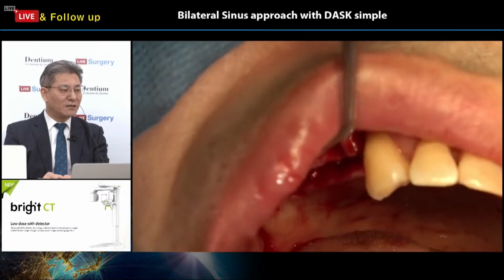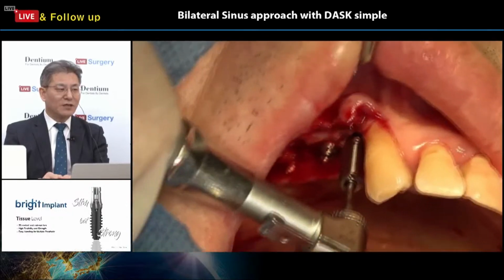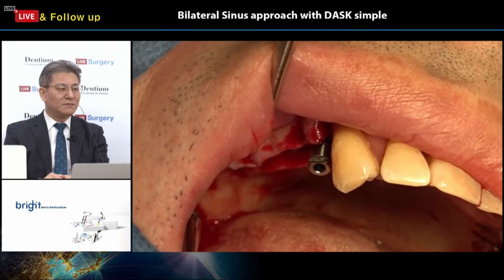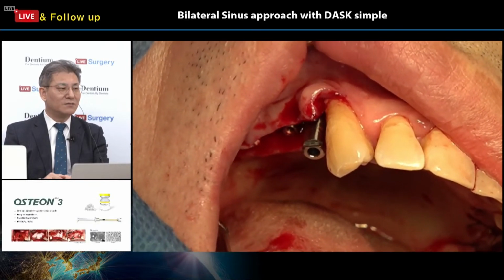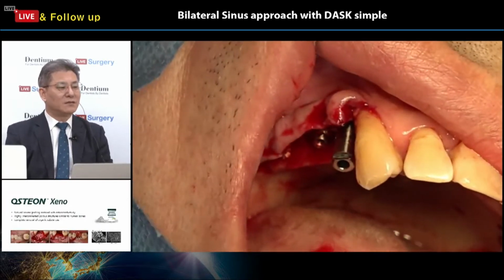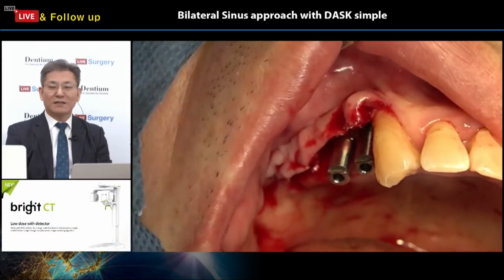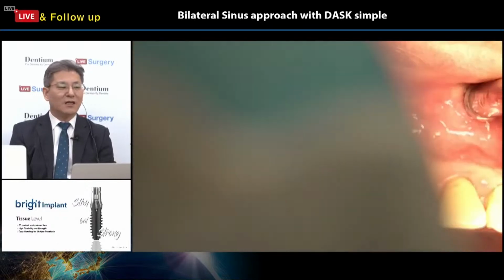He wants to connect the scanning jig, the scanning cap, actually the comfort cap, the official name is comfort cap, with dual function: scanning jig and healing. Because of the higher insertion torque, okay, to a tissue level, connected with the comfort cap, a scan comfort cap for intraoral scanning actually.